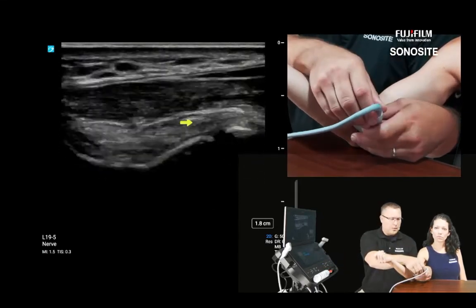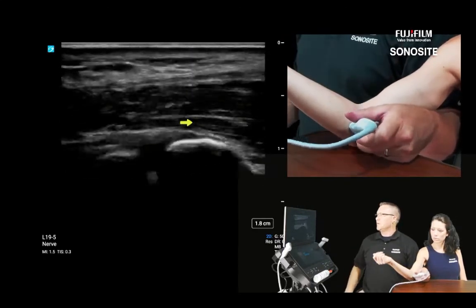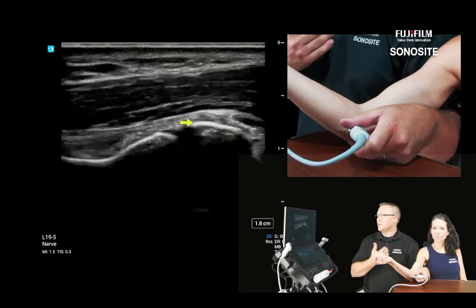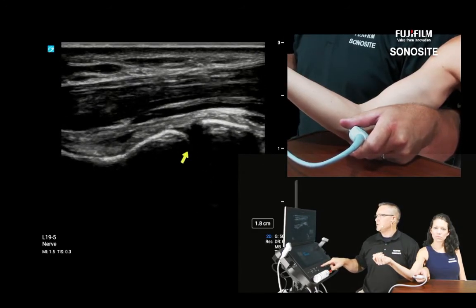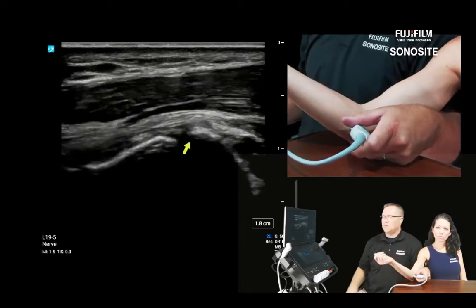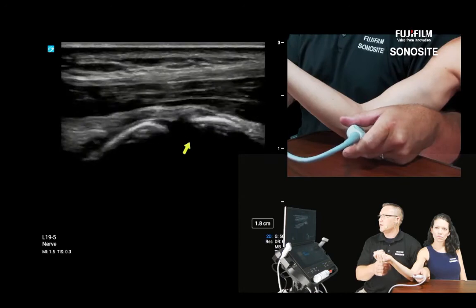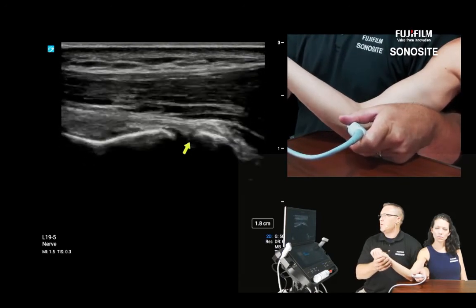Now, when you're doing a dynamic exam, the way I'm sitting right here with the camera, I was noticing kind of in our warm-ups, we don't want to arm wrestle the patient too much and put too much stress and tilt on the patient. So let's watch this joint and watch what my shoulder's doing up here in the bottom of your screen. I'm just going to bump shoulders here with our model and act like a rest. And then since her elbow is bent at least 30 degrees to disengage the olecranon process from the fossa, I'm just going to go ahead and do that arm wrestling maneuver, okay?